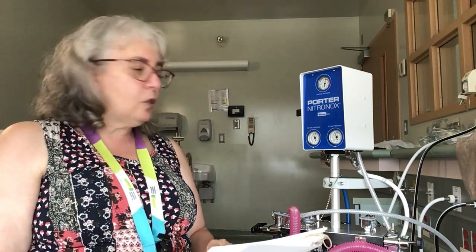And obviously if they vomit and this is all a mess, we can change it for a new one. Emergency situations, so this is where we would need to involve the obstetrician if we have a midwifery patient or an obstetrical patient and or possibly a family practice patient, but it is related to the earache, which is due to an increased pressure in the middle ear, which, as I said, could lead to a tympanic membrane rupture. So we're going to stop the use of the gas, and we're going to possibly need a referral to ENT.